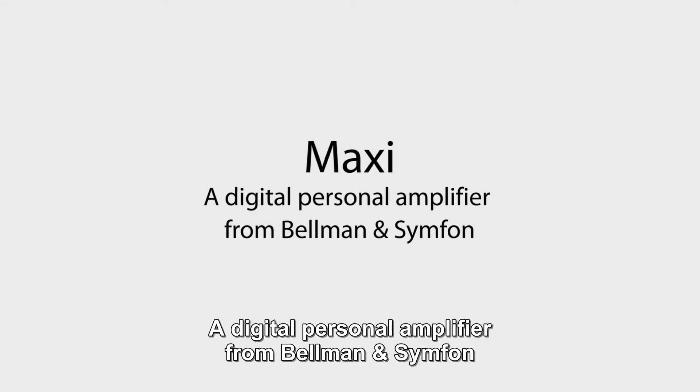A digital personal amplifier from Bellman & Symfon. Getting started.